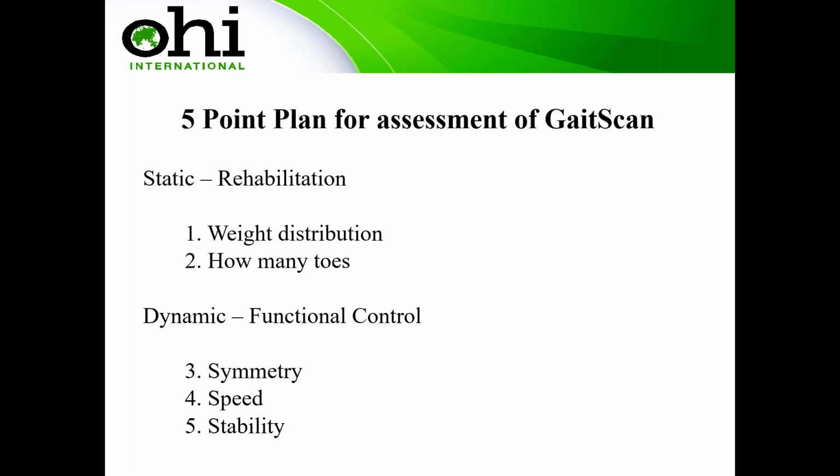It also has 2 parts. Static, which is all about rehabilitation and is underutilized, so we're going to talk in depth about that now. And dynamic, which is all about functional control. So let's look at the static. Static's all about weight distribution and how many toes.